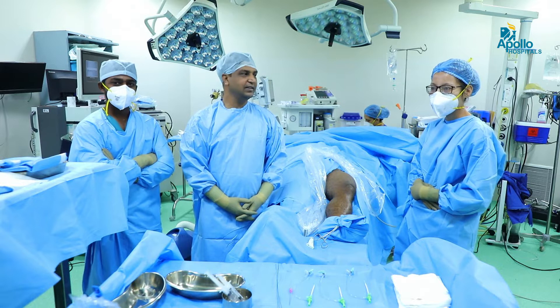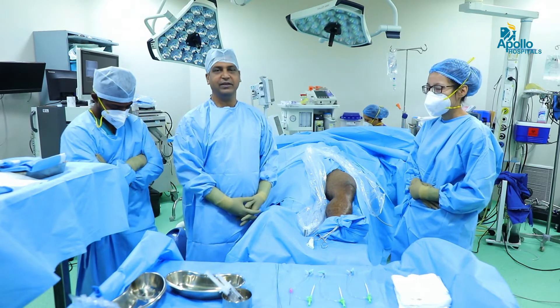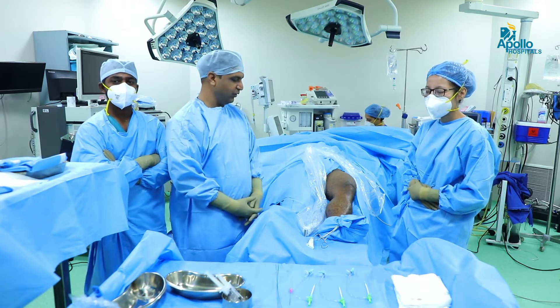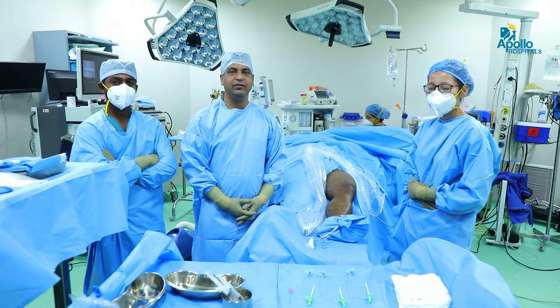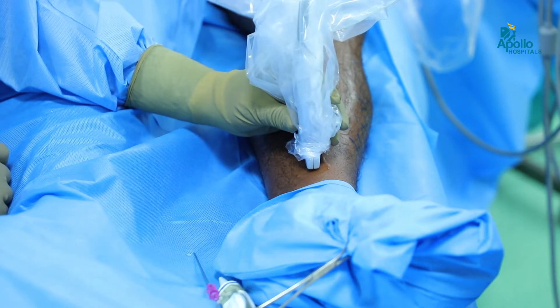I'm Dr. Shashidhar and this is my team. Today we are going to operate a minimally invasive endovenous laser ablation procedure on a young fellow who is suffering venous insufficiency due to great saphenous vein varicose veins. This is a minimally invasive procedure done under ultrasound guidance as a daycare procedure under local anesthesia.